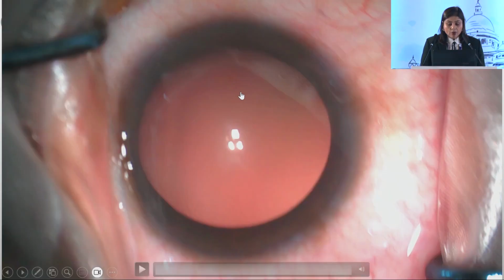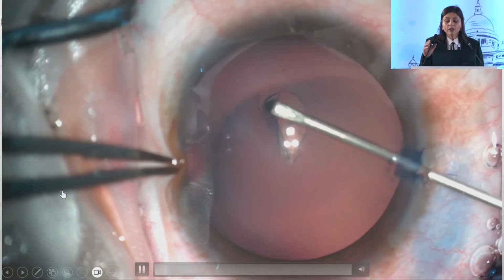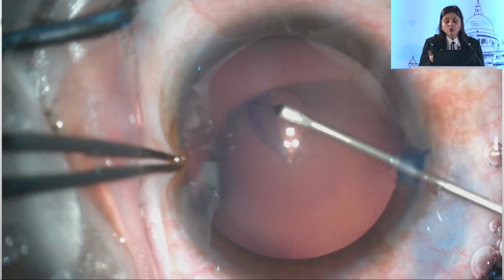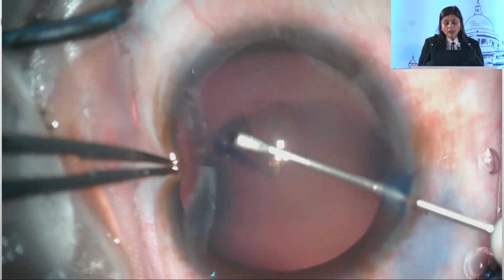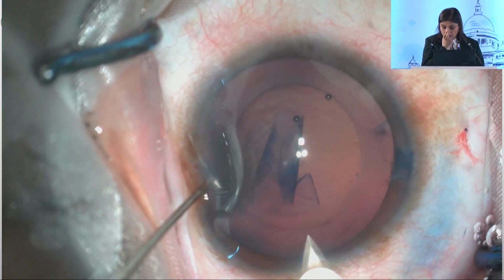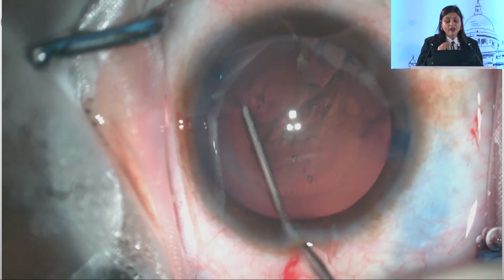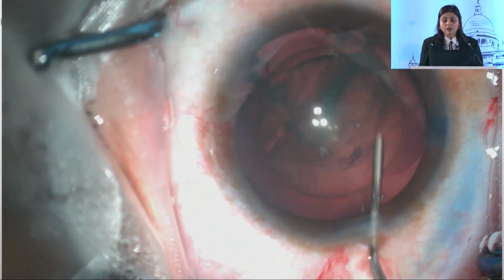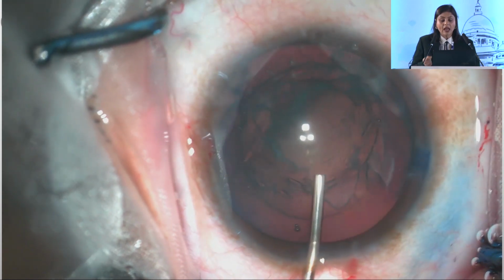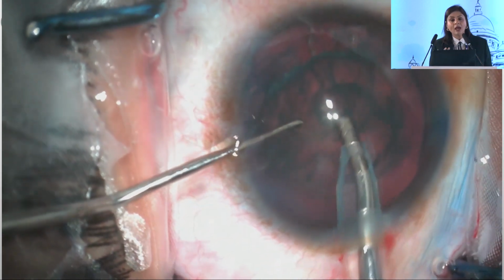Now let's look at a few cases. This first patient is actually undergoing refractive lens exchange. So there is no cataract, it's a very soft lens. Here we managed to complete the rhexis with the cystitome. We have a good sized rhexis, so the technique that we use in very soft cataracts where the rhexis size is adequate, say at least 5.5 millimeters, is just with the hydrodissection cannula, push the fluid wave till one of the poles of the nucleus prolapses up.